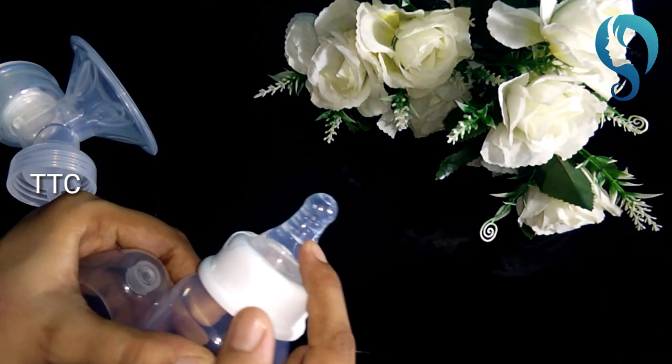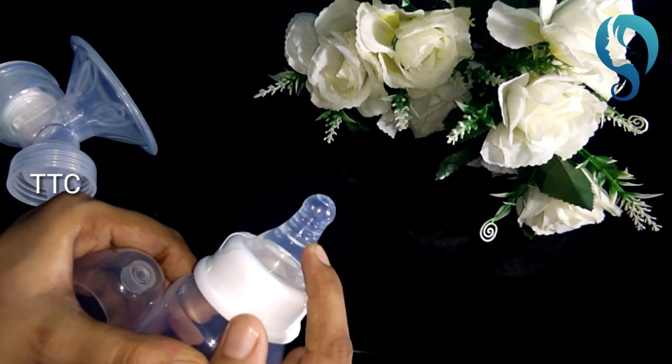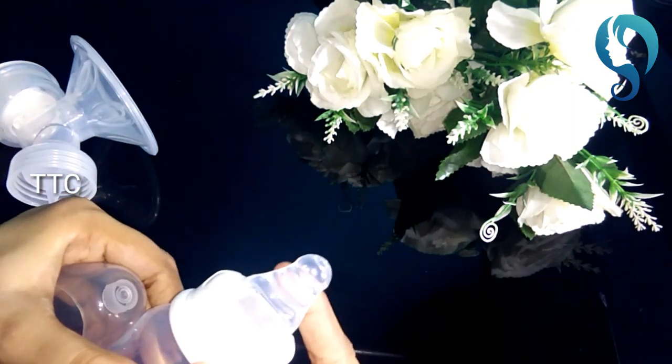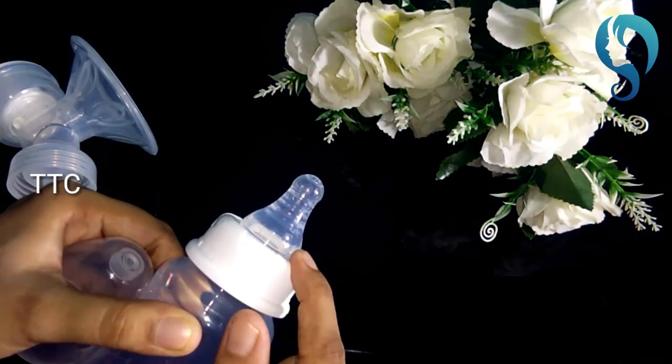It is a manual breastfeeding pump. You can suggest it to others. You can present it as a gift to a relative — they will be very happy.